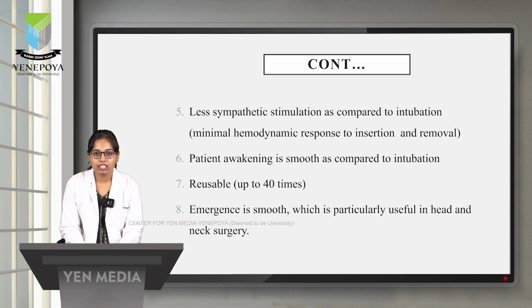Less sympathetic stimulation as compared to intubation. Patient awakening is smooth as compared to intubation. Reusable up to 40 times. Emergence is smooth, which is particularly useful in head and neck surgery.